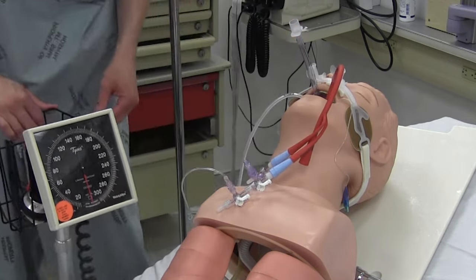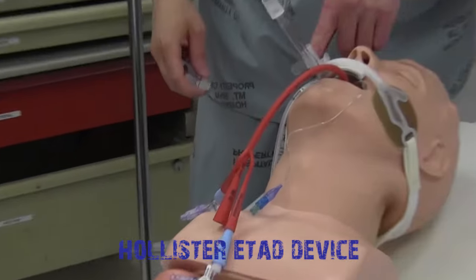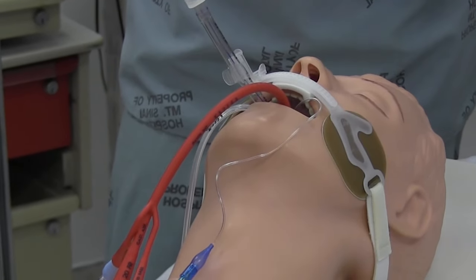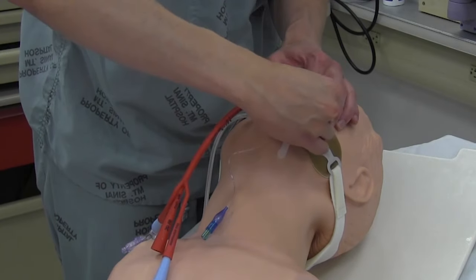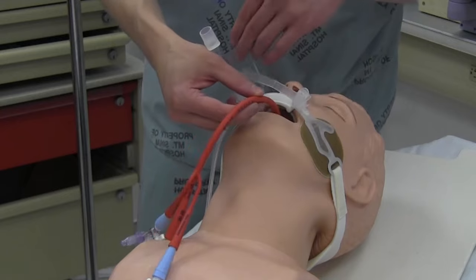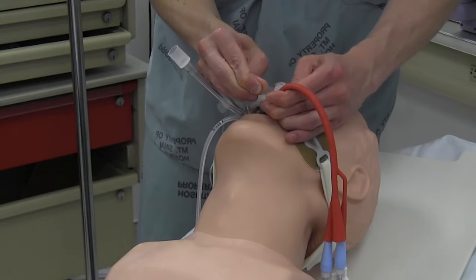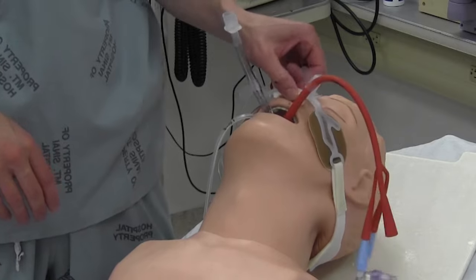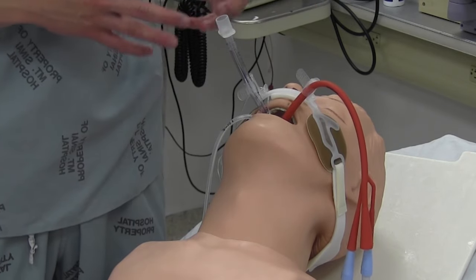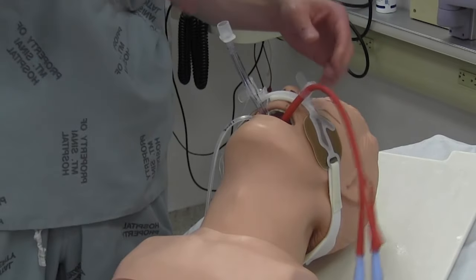And that's essentially it. Our favorite tube securing system is the ETAD by Hollister — I don't take money from these guys, I just think it's a brilliant system; it's what holds our ET tubes in nice and tight. What I discovered is you can take a second rail device from another ETAD and add it to the rails. Then you can take your Blakemore while it's under tension from the IV bag and secure it to the Hollister system, allowing you to take it off the IV pole traction. I use this same thing for securing epistaxis catheters or anything that needs to stay in the mouth — it has these nice little grip spikes, so the tube stays under tension without all the rigamarole hanging off the wall.